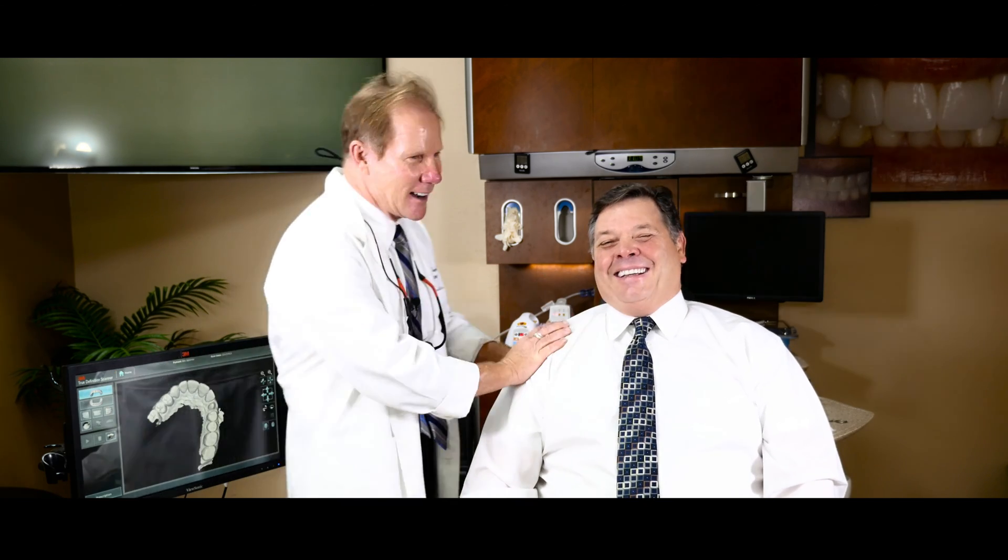You're a tech-savvy person, so the technology certainly makes you feel better about that. I'm keeping up with what technology is offering us as clinicians and we're doing the very best we can. I think it all begins to come together with the technical expertise that you have, the dental laboratory that you use, and the materials you're using today to really give us a nice smile that's going to last the rest of our life. Absolutely — we hope so. Yes, until you break another one.